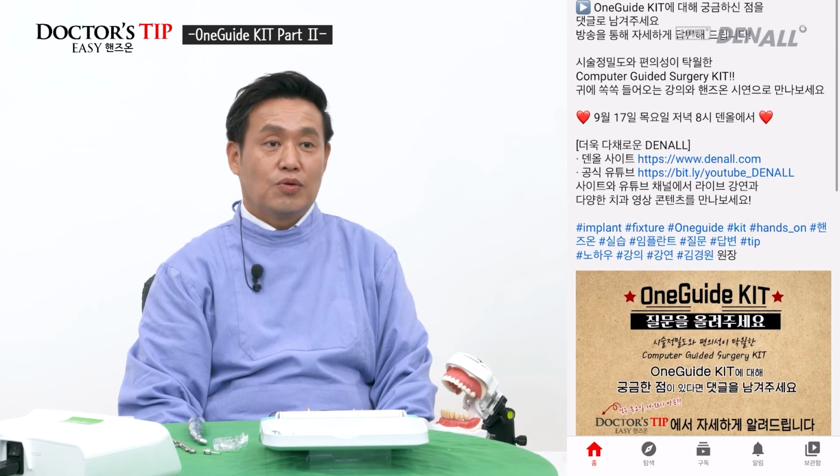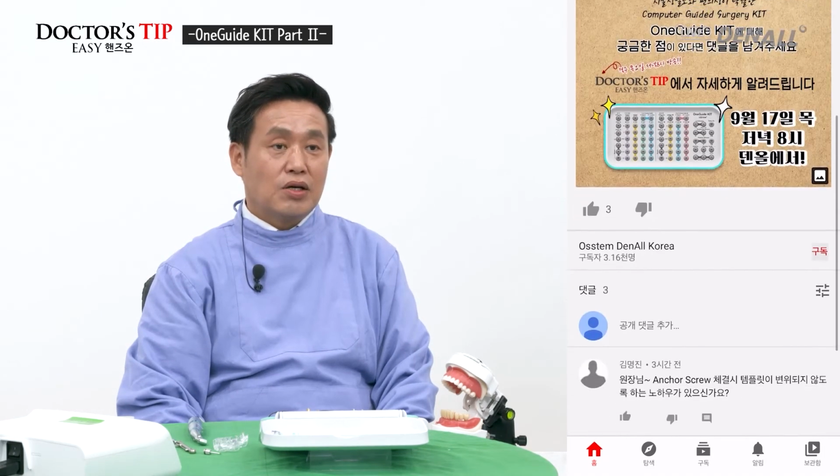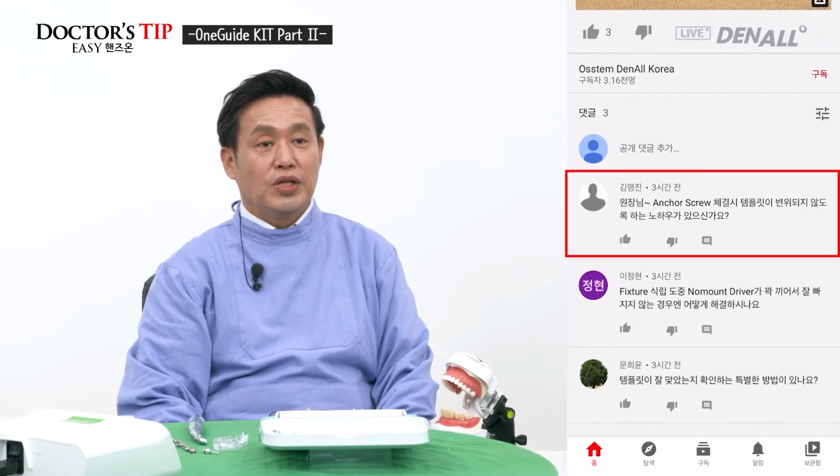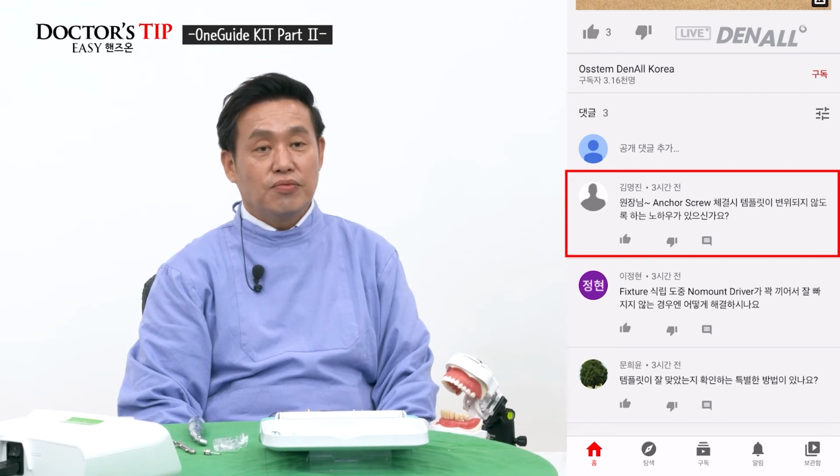Let's check the questions. This is from Dr. Kim. Is there a know-how so that template is not deviated when we connect the anchor screw? We use anchor screws when it is fully edentulous, like the case that I've showed you, or when the distal free end is quite long span. If there's remaining teeth, you can check position.